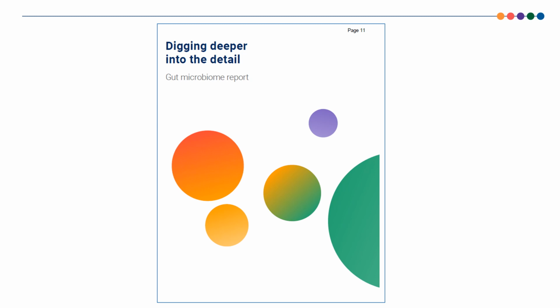We will go through the Digging Deeper section in detail so you can become familiar with all of the metabolites assessed on the Microbiomix report.